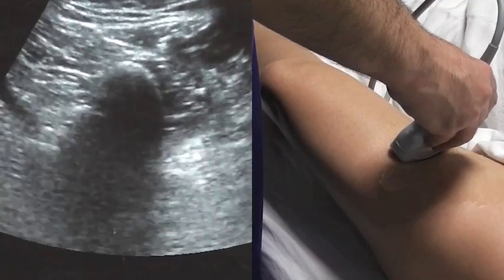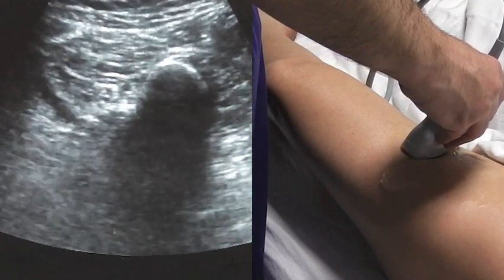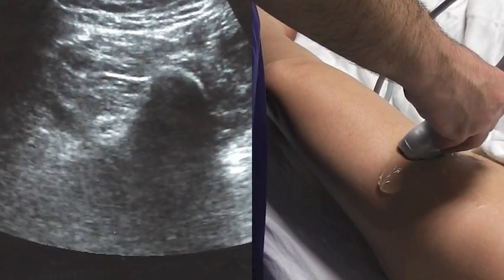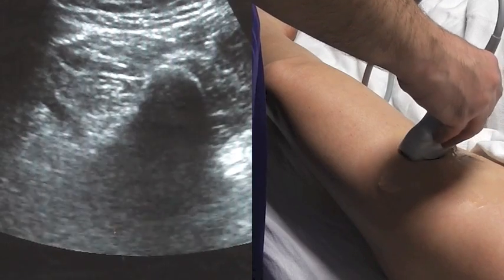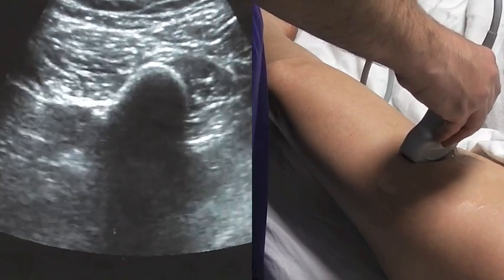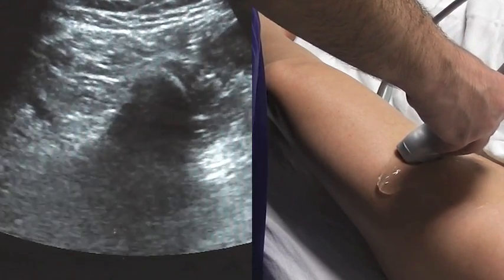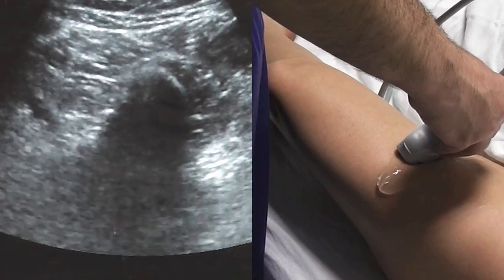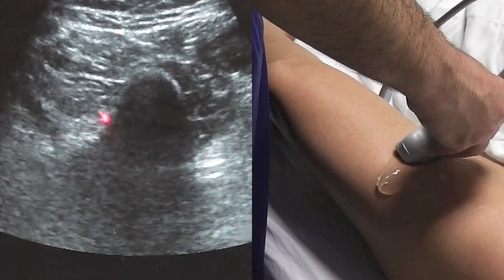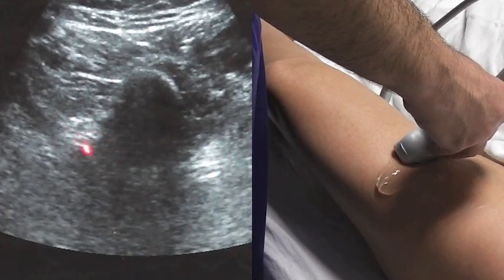I'm gently going to slide my probe a little more medial and a little bit on both sides. You can see how, when I do that, the sciatic nerve comes into picture right here.